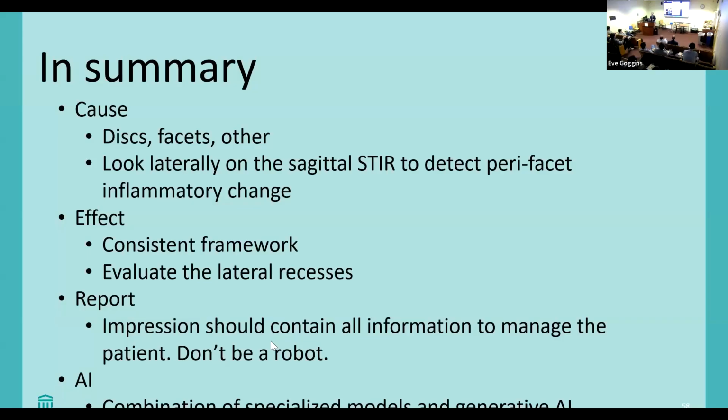What they tell me is that the best thing to have, kind of counterintuitive perhaps, is a sequestration, because that's going to be the most likely to resorb on its own. I don't know if I'm just conjecturing here, if protrusion, since it's on the way to a sequestration, is going to be more likely to resorb. But again, I don't know.